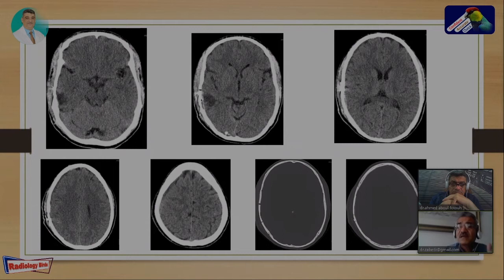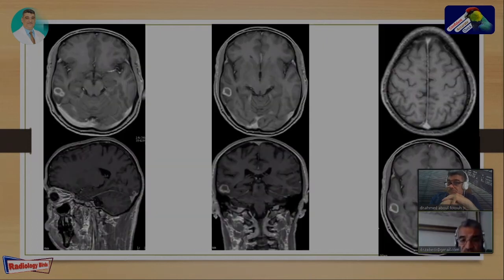As I told you, regarding the patient, there was a change in the report. I said it's okay. I saw that the lesion had contrast enhancement and irregularity of the border. And we have such cases, of course. I thought of a TB. I told our colleague who was there, the young radiologist, please change the report. I'm sure that the cause of convulsion can be this, but the coma, maybe there is another factor for that, or the severe convulsion itself.